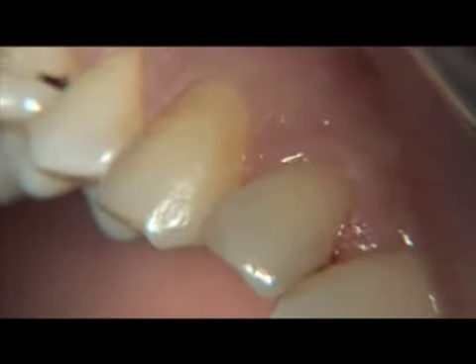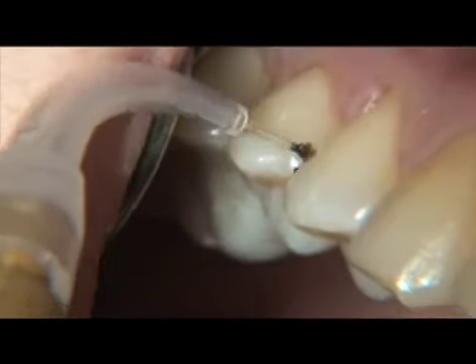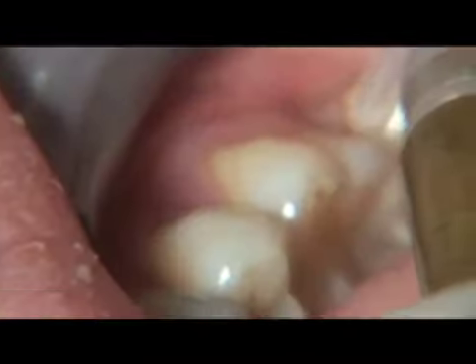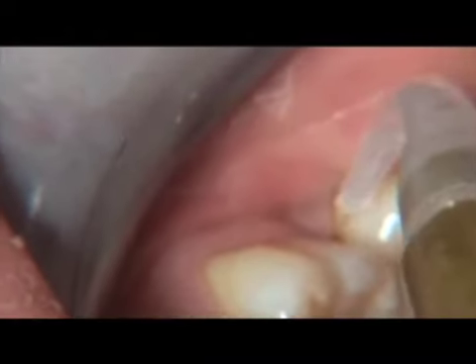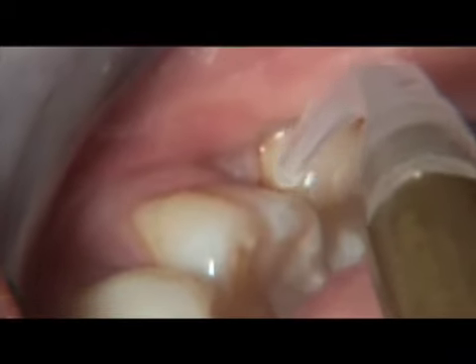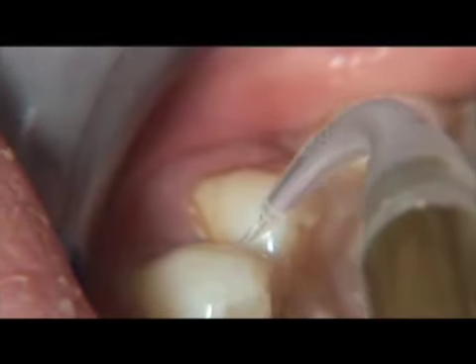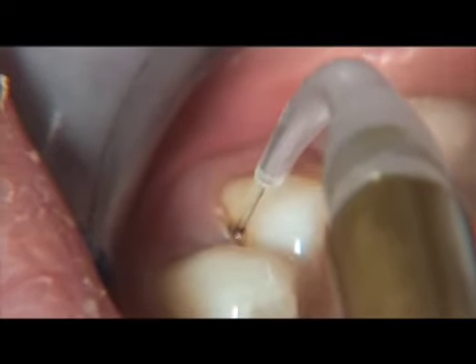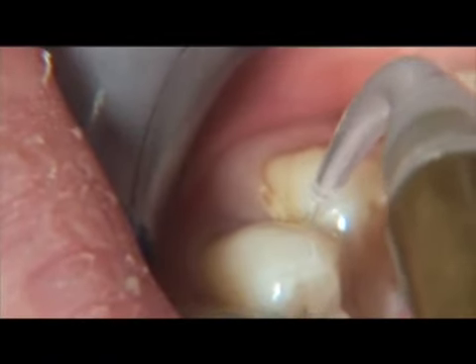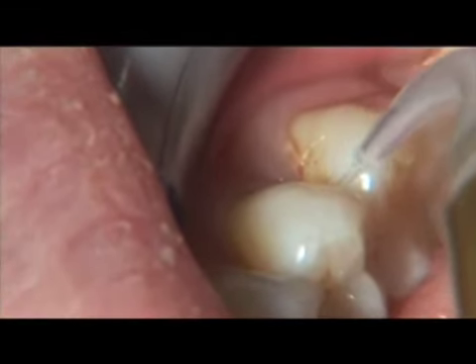The laser is set in a continuous mode of operation with a power setting of 0.4 to 0.6 watts. Remember that the fiber must be initiated for laser curettage. The technique utilizes a light paintbrush stroke while moving the fiber from the base of the pocket to the coronal portion of the tooth. Make sure you are aiming the laser fiber toward the lining of the epithelium and not the root surface, as this technique will remove some of the diseased epithelium. In highly infected areas, light, fresh bleeding may occur.